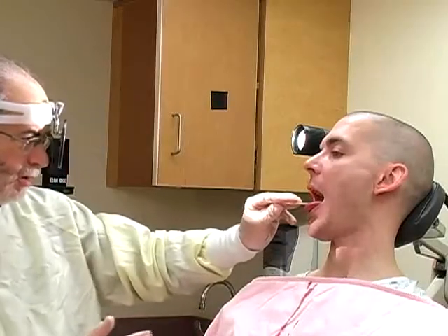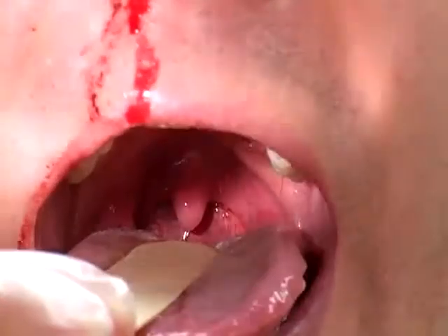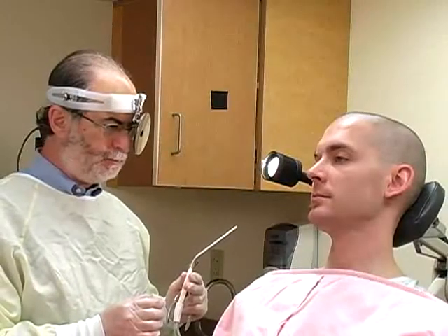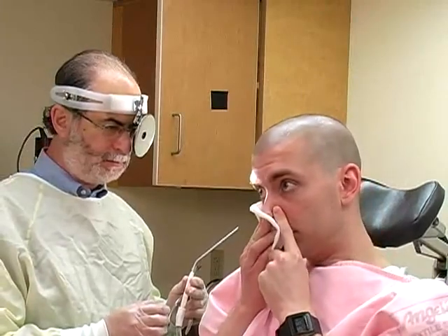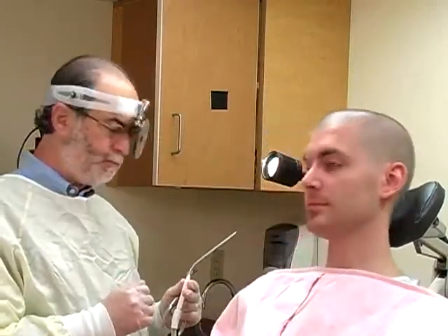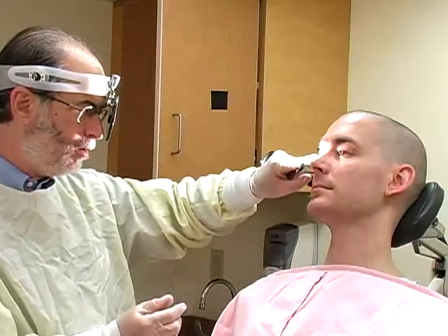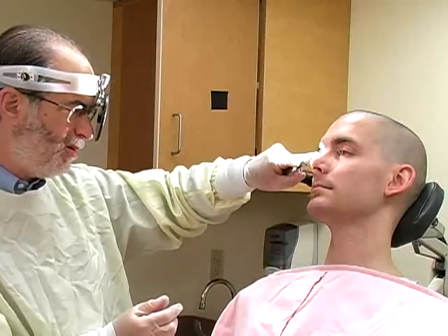Check the posterior oropharynx for blood coming down from the nasal passageways. Instruct the patient to gently blow his nose to clear away any clots or blood. Then, use a nasal speculum to evaluate the anterior nasal canal.